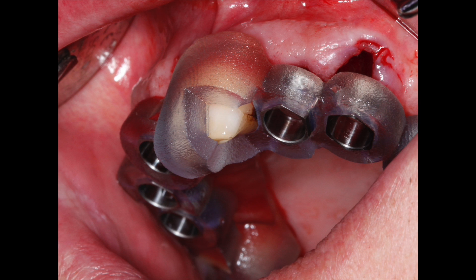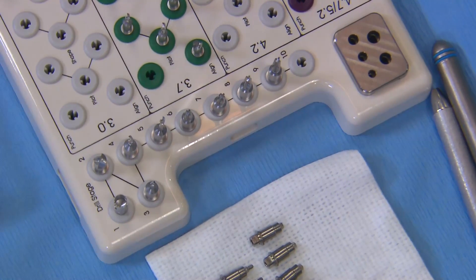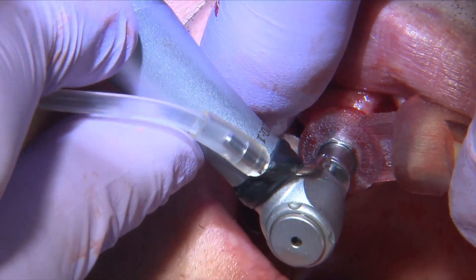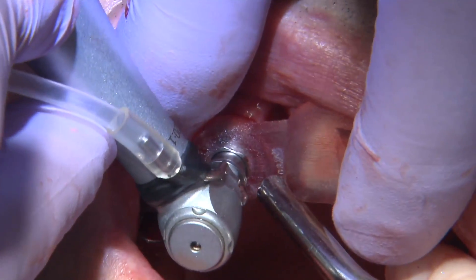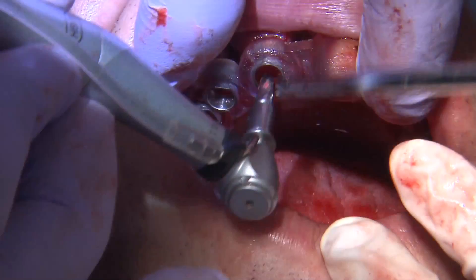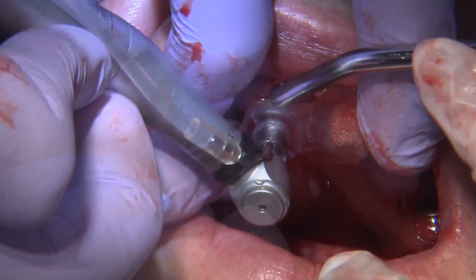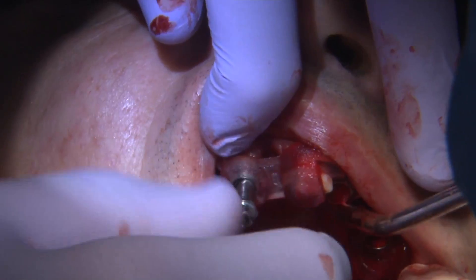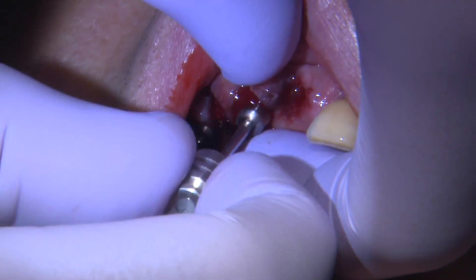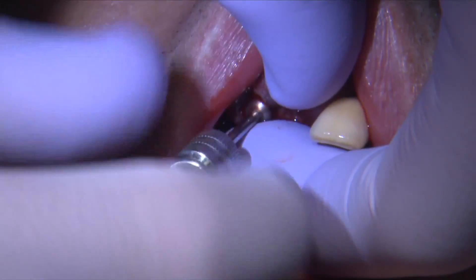I went with a tooth-borne surgical guide for stability — if you extract all the teeth and use a tissue-supported guide, the tissue may not support the guide to the same level as natural teeth would. Once the surgical guide is in place, I begin the osteotomies and widen them using a surgical drilling kit. Once the osteotomy is created, I place the implants through the guide to the exact location predicted during digital treatment planning. I then place healing abutments to preserve the soft tissue and prevent collapse on top of the implant platforms.